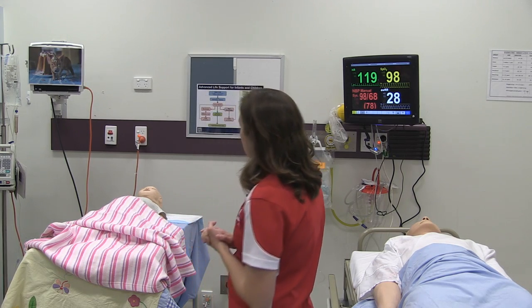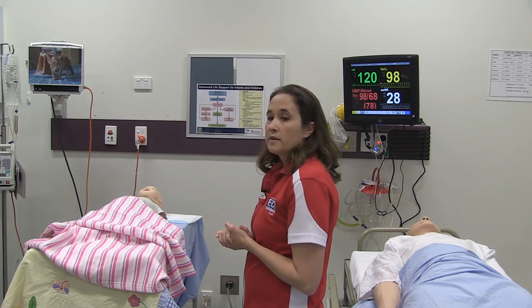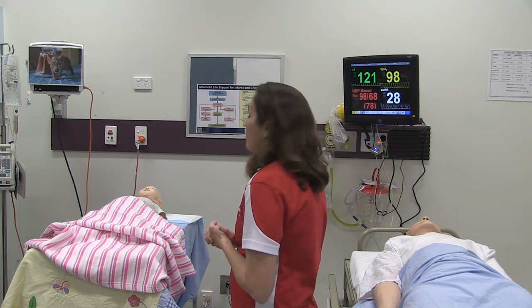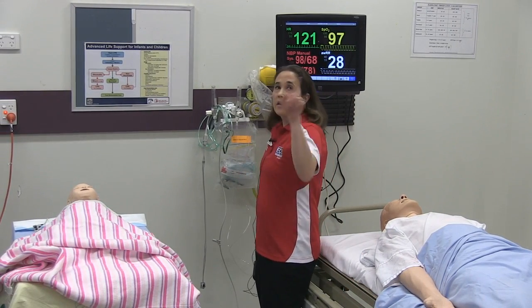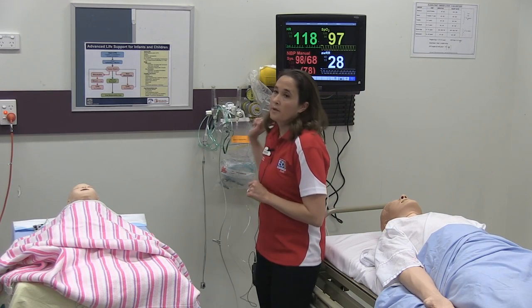When we bring our participants in, the first thing we do is show them the room, let them ease into the environment, and then we show them how to call for help. There's a few ways to call for help. Hit this blue button. That sends out a call light in the hallway and a noise. You can also cancel it with the gray button there.